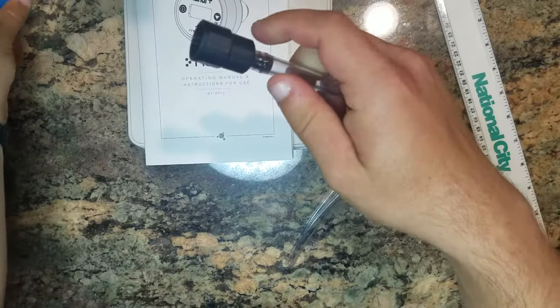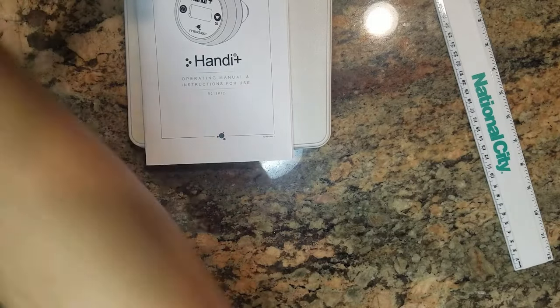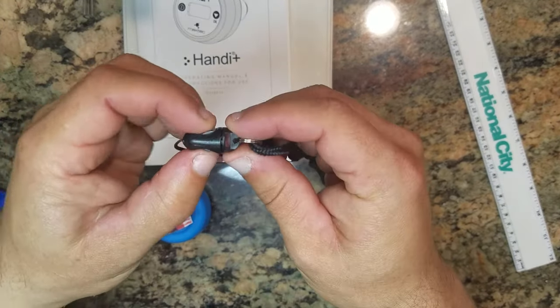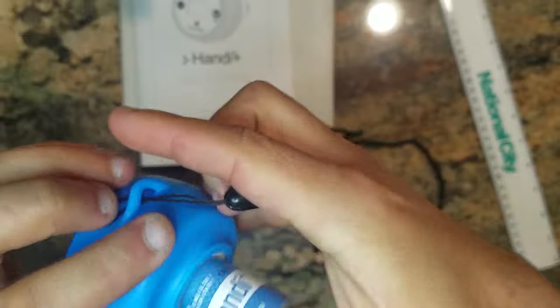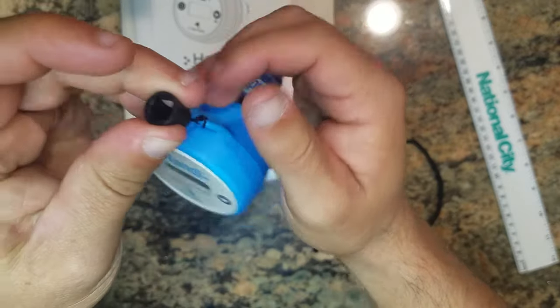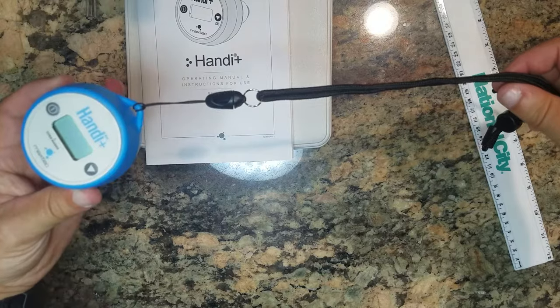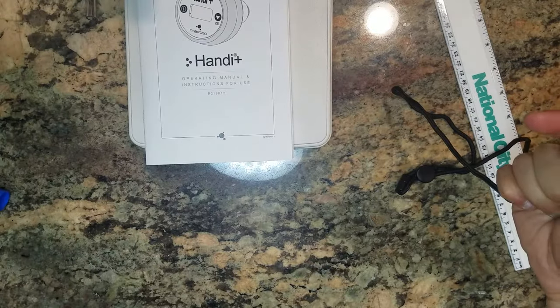We've also got a carrying strap. The way this works: there's a little snap here, then you run it through this little opening and girth hitch it like this. Now you can loop this around your neck, and it has a quick detach.